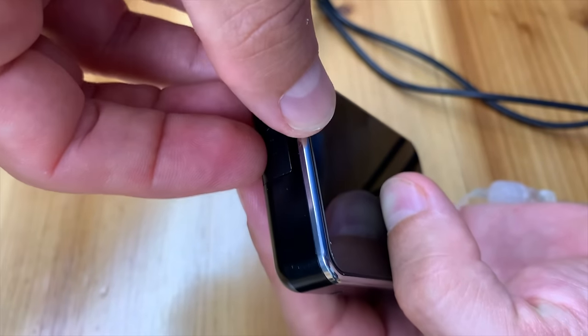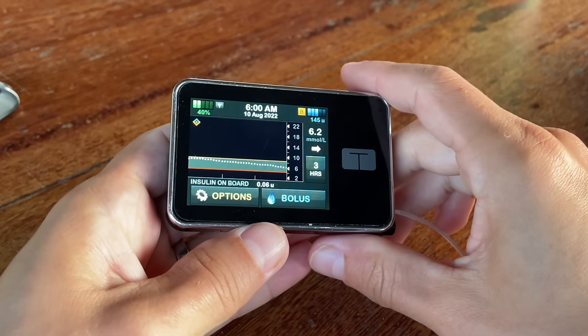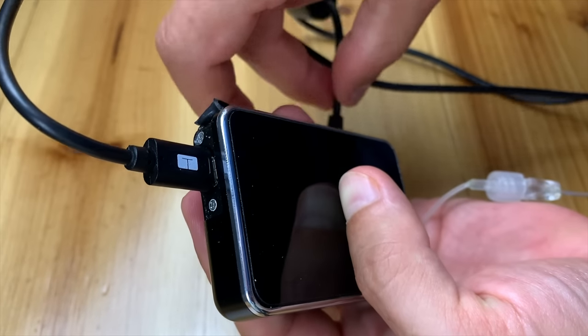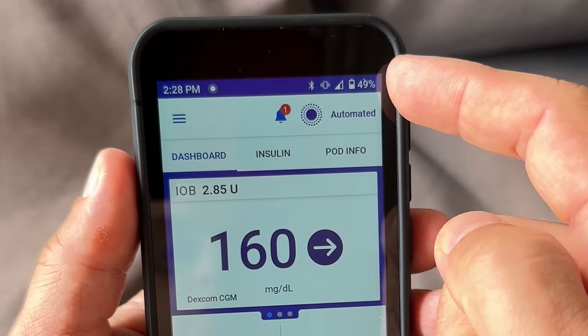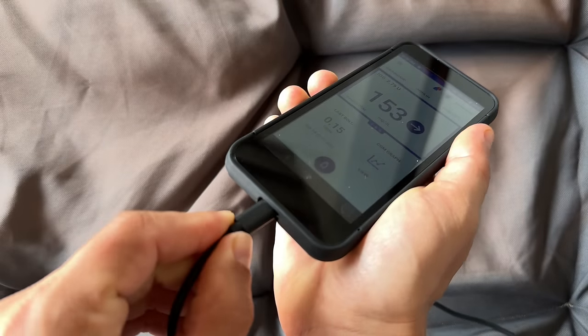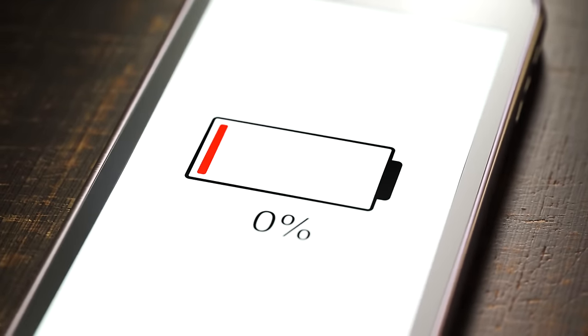Next, battery life. The T-Slim has a USB rechargeable battery; from my experience I can go about four to six days using Bluetooth to read data from my CGM. The pump takes about an hour to fully charge, during which you're tethered to a cord or USB bank. The Omnipod 5 controller battery lasts about two days or sometimes less while using Bluetooth. The Omnipod app will cause additional battery drain on your phone, but the pod itself on your body doesn't need to be connected to anything — you're just charging the remote controller, which is a very different and easier experience.